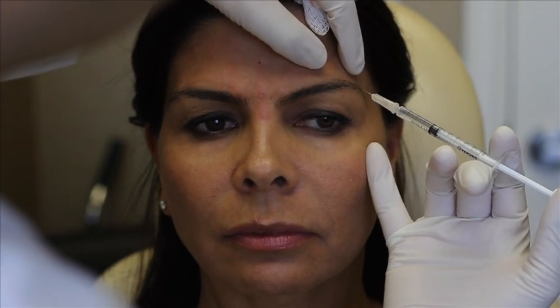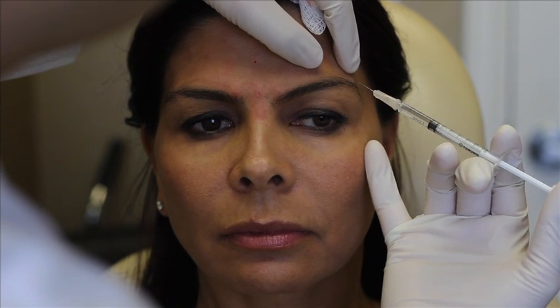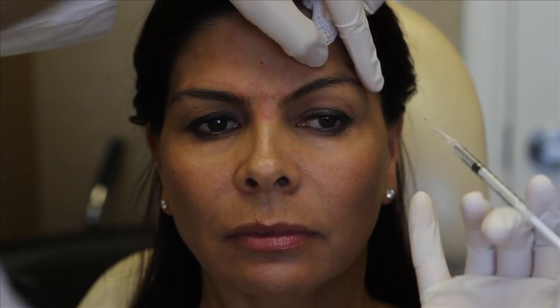I can also raise the corner of the brow by inhibiting the depressors of the brow. So the depressors of the brow are right here, so you go right on top of it, pull it up, and inject that. And by doing that, we can raise the eyebrow about 2 or 3 millimeters in a nice fashion. So you want the temporal brow to be raised, so it gives a nice temporal flare. And go ahead and raise it and relax it. So you come same side, same concept on the other side. Raise it up and relax it.